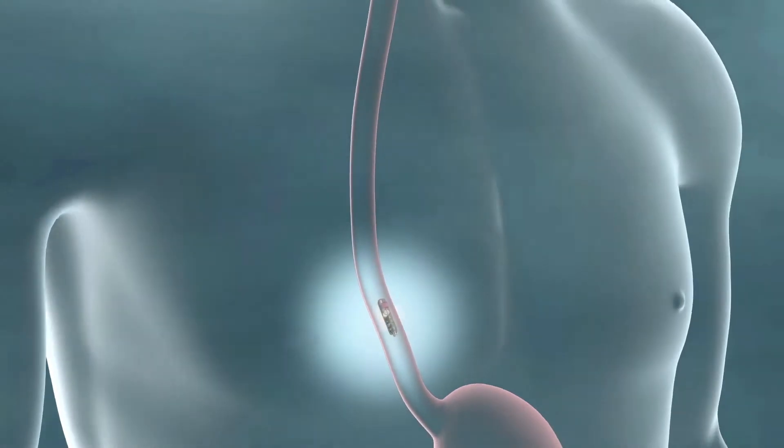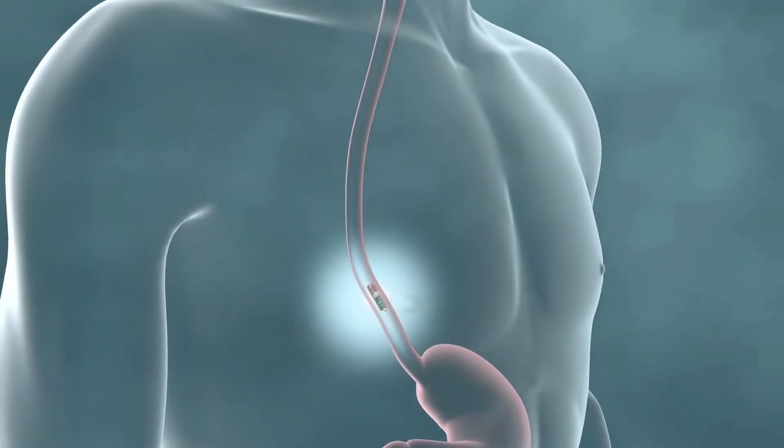A PH test measures the degree of acidity in your esophagus. Fortunately, we have the capability to offer you a wireless and catheter-less way of measuring your esophageal PH, which is much more comfortable. That is called the Bravo PH monitor.